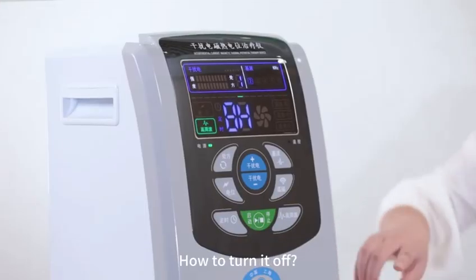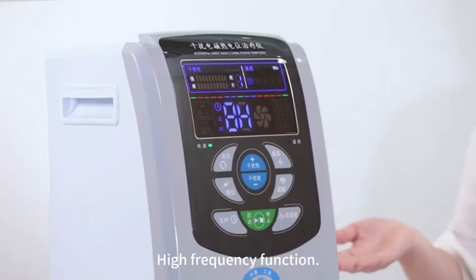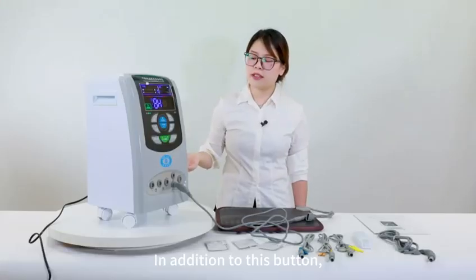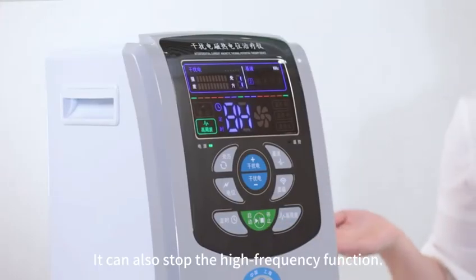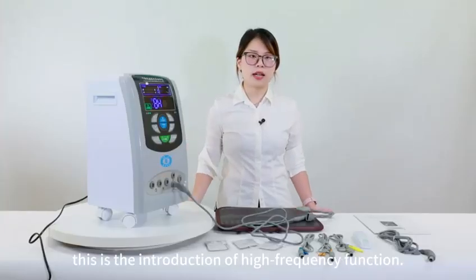How to turn it off? You can click it again. The high-frequency function is turned off. In addition to this button, you can also click the Start-Stop button. It can also stop the high-frequency function. This is the introduction of the high-frequency function.